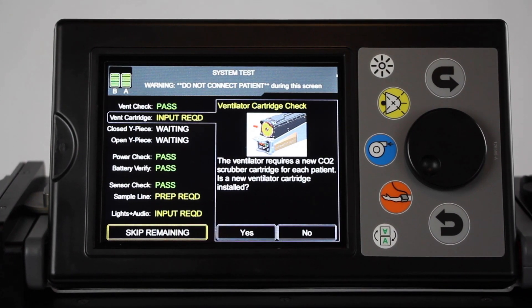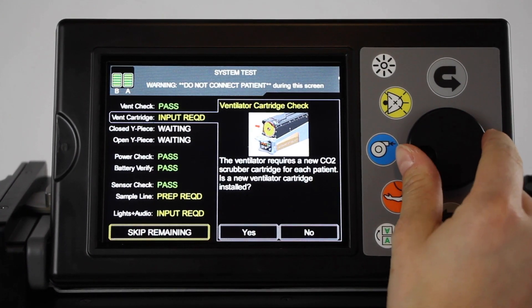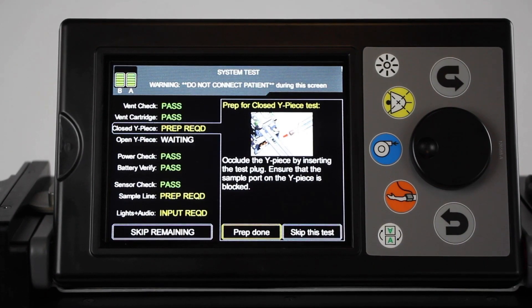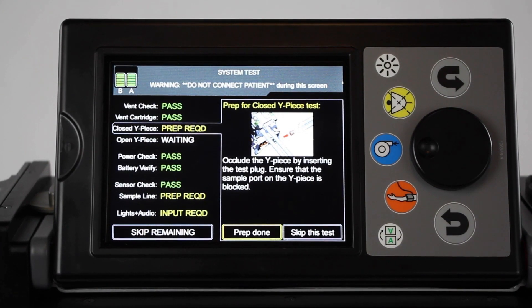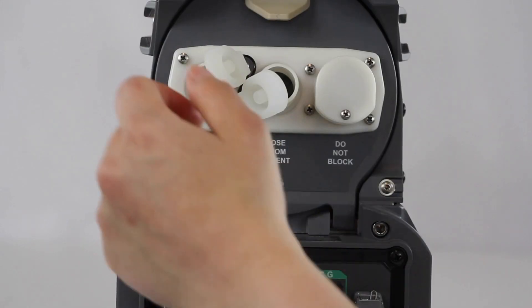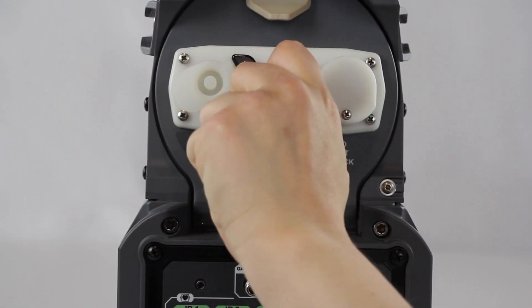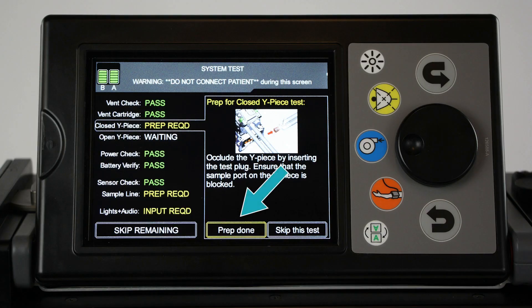The first test, Ventilator Cartridge Check Test, requires user input. For the purposes of this procedure, a ventilator cartridge is not required. Select Yes to continue. To complete the closed Y-piece test, simply ensure that the ventilator port covers are installed, then select Prep Done.